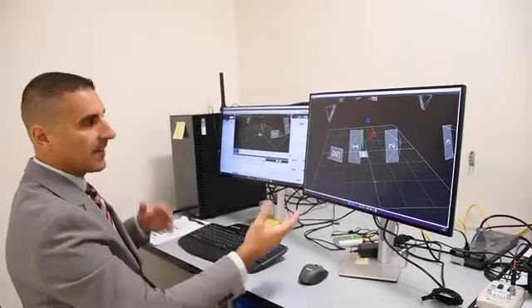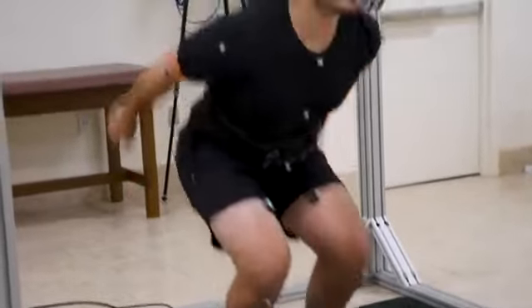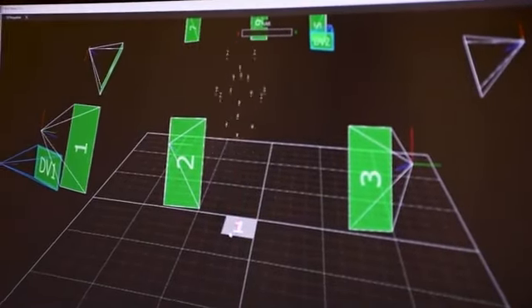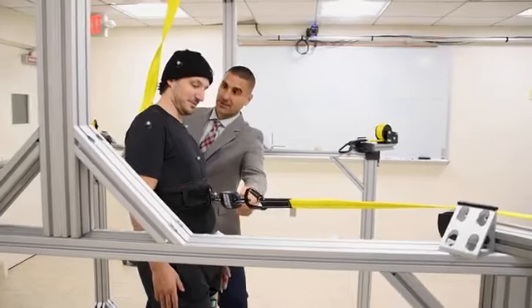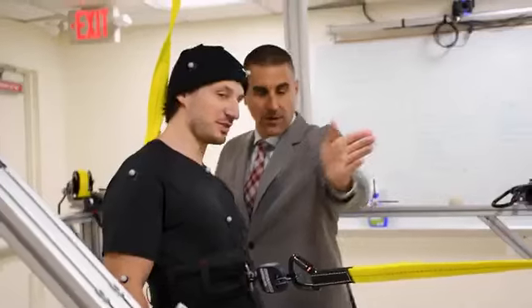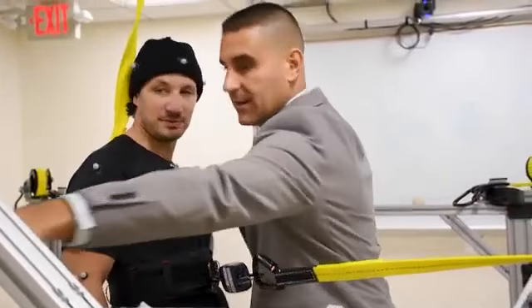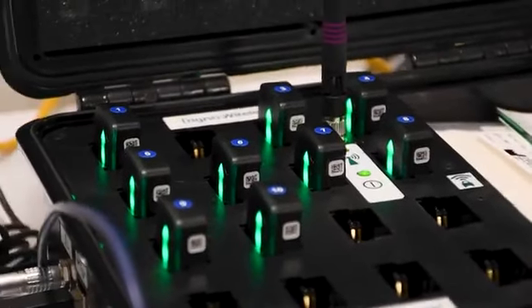The subject leaps in place. The dots mapped in 3D space repeat his motion in the 3D environment. We also have force plates that we can use to compute the forces that the body exerts on the ground. A second harness is strapped to his waist. And then we can estimate postural balance, for example. And then we use electromyography, or EMG in short. A bank of lit tubes in a case with cables beside the rig. Those are sensors that we use to register muscle activity.